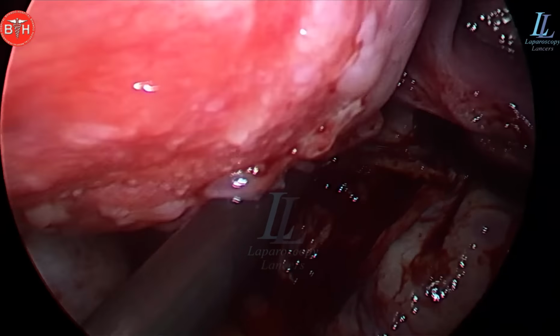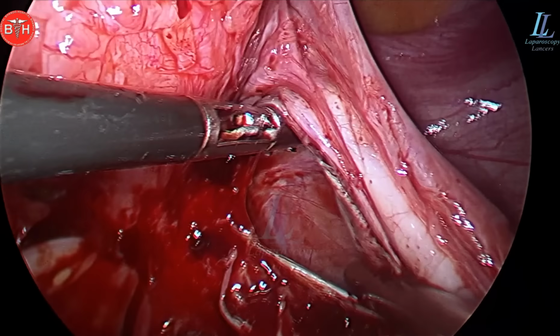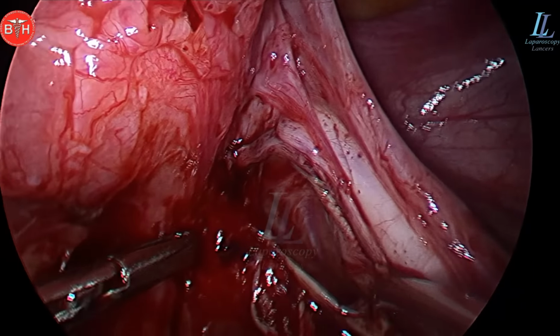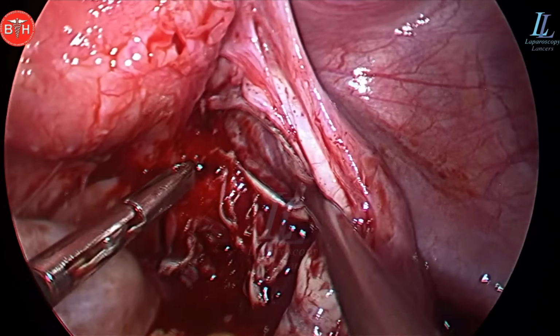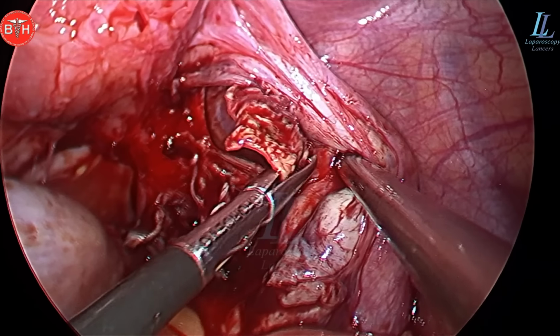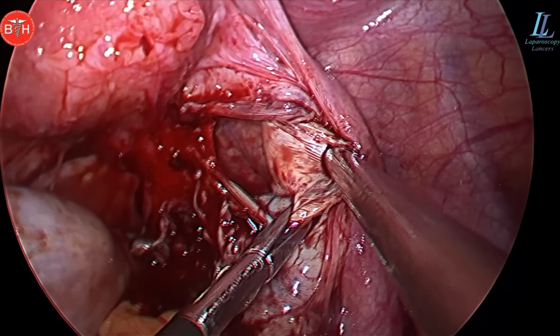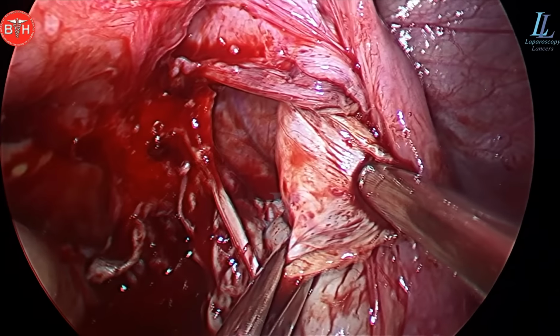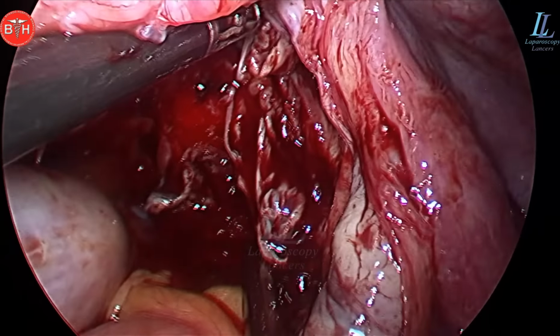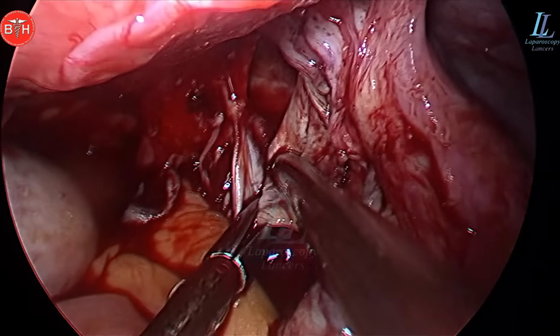That's the ovarian tissue. I am looking through the ovarian tissue. Nothing much to be done over there. It's not an opening in the broad ligament, and just the opening behind the ovary and the mesoovarium. That's the space that I am seeing. It's not a through and through opening, so no worries, no need to close it. And don't worry, no hernia will form, and there will be no strangulation of the hernia over there, so we can leave it alone.